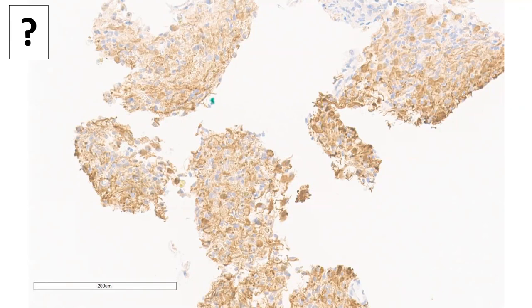All right, so someone unmute and tell me, what is this marker which is staining beautifully all of these gemistocytic neoplastic cells just like GFAP in an identical pattern to GFAP? Cytoplasmic only, no nuclear staining, all right? It's identical to GFAP. What's the marker? Anyone want to take a shot? I'm sorry, say again? S100?